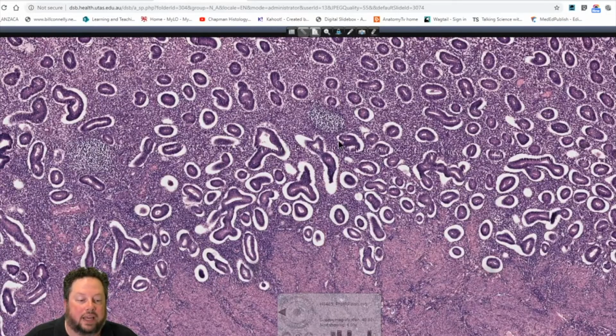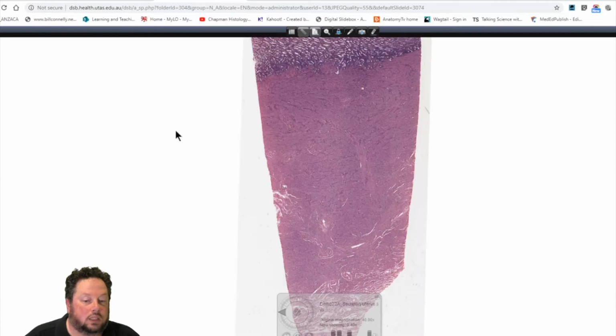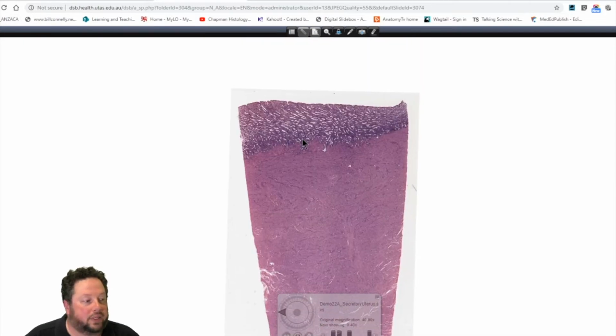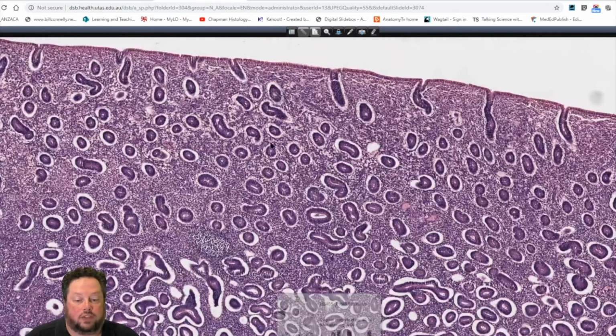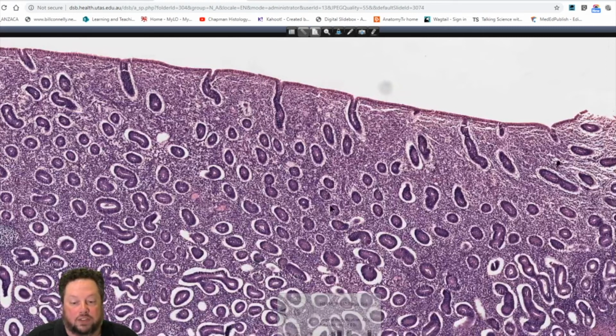You get a little bit of branching happening down the bottom here, and of course if we think about it, it's actually a continuum, isn't it? So from menses to proliferative to eventually becoming secretory, those glands are going to change over time according to the hormonal profile. Here we are looking at the proliferative phase. So these are the simple, straight tubular glands of the proliferative phase. Nice straight glands, you can see them nice and round in cross-section.